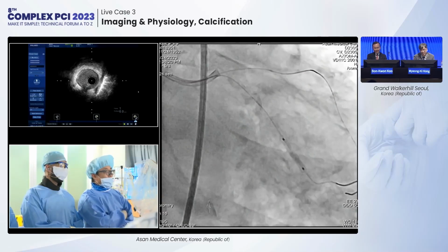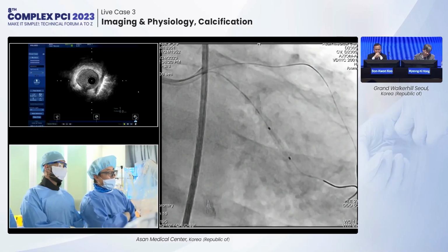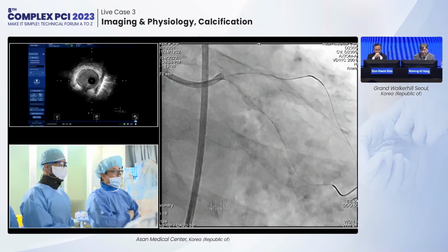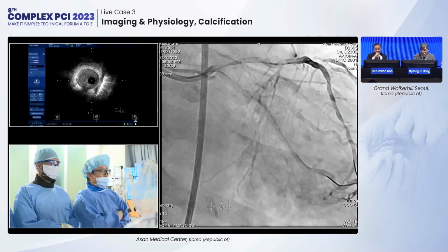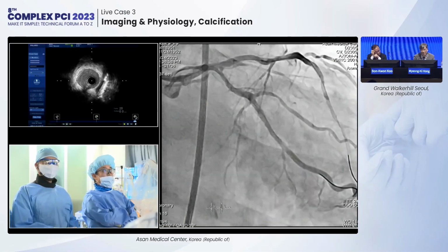The distal part did not pass the IVUS, and we also did aggressive dilation using a 2.75 NC balloon. Next one. This is the full adaptation of the NC balloon to the distal segment. We also checked IVUS. Could you show IVUS in the distal segment?